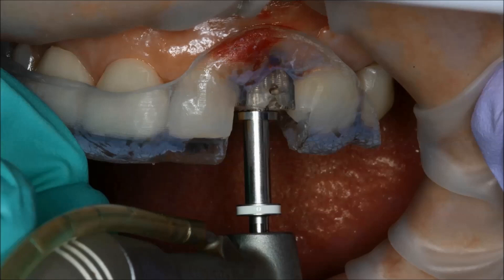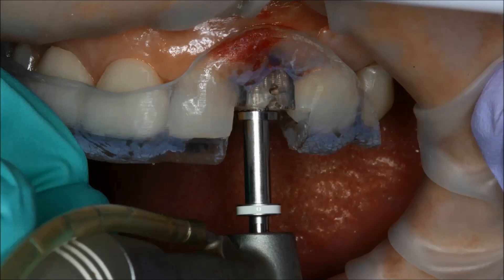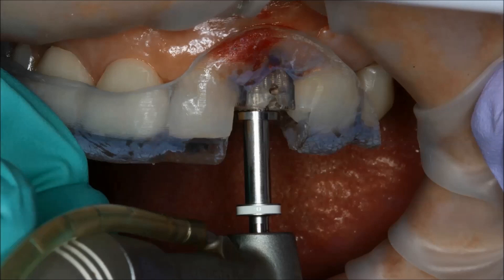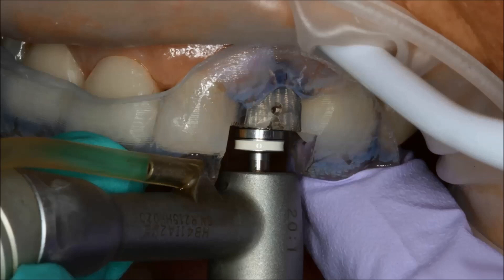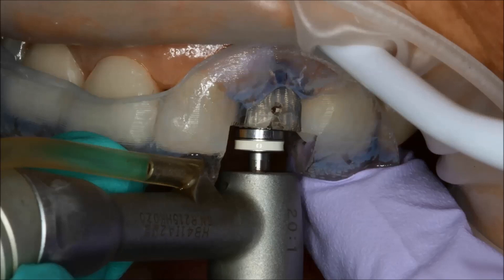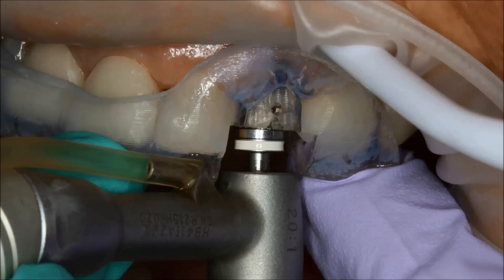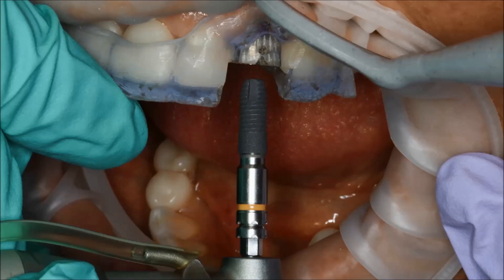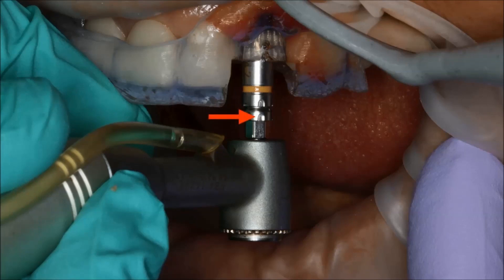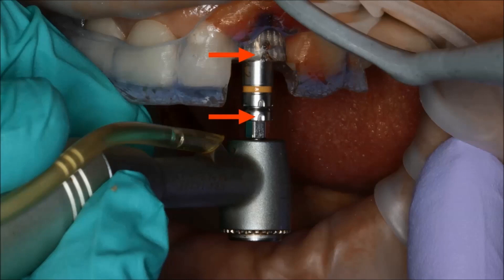All of the drills included in the case have a sleeve already attached to the drill, so it truly is a keyless surgery — there's no need to insert any sort of a key into the surgical guide. You simply take each drill, insert it into the guide, and seat the drill until it hits the vertical stop. Once that happens, we know we are at the exact right vertical depth for our osteotomy. We then remove this drill and repeat the sequence through all the drills needed for the case, and then we'll use our implant driver to pick up our implant. It's critical to make sure that the indexing on our implant driver — that large notch — once we seat the implant to depth, lines up with the notch indicated on the surgical guide.